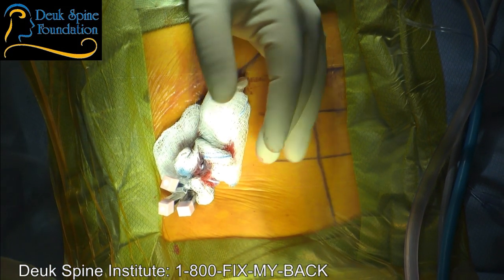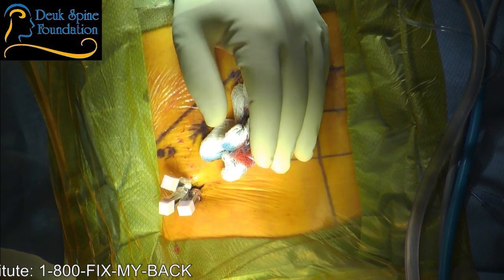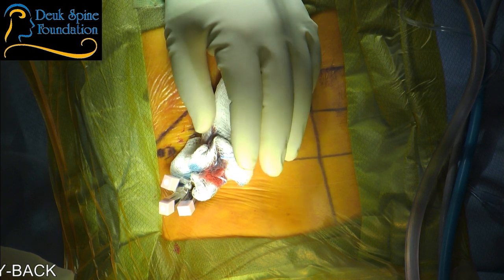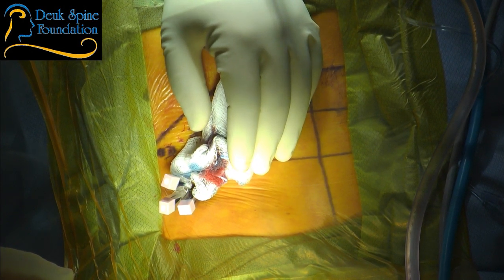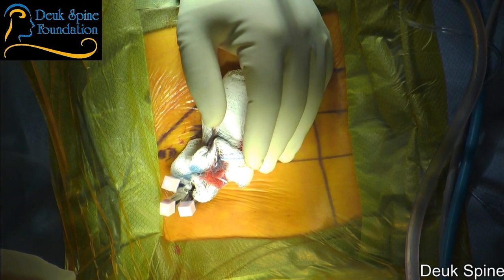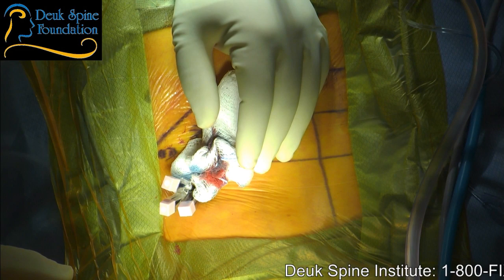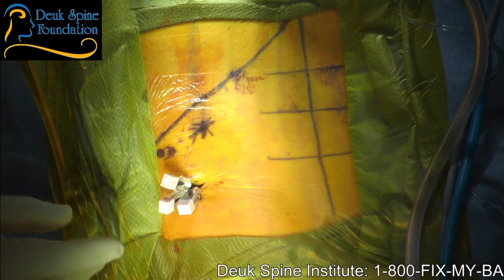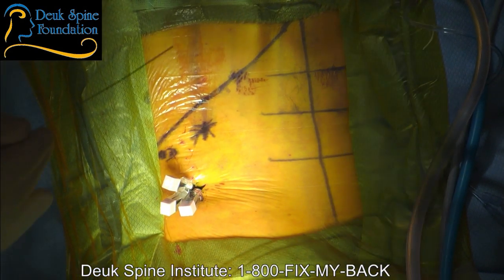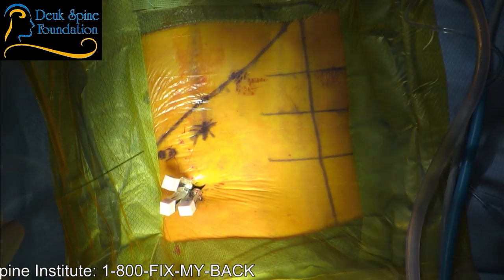But you're not really here for back pain. You're here for your leg symptoms. So we're really doing L5-S1 for the radiculopathy. Yes, we're doing it for the radiculopathy weakness rather than axial discogenic pain. But there are millions and millions of people living with back pain of the kind that you felt when I injected L3-4 and L4-5 and reproduced your pain. And that's the disc. It has nothing to do with the facet joint or the muscles. L5-S1 is 0, and then L4-5 was 8, I think, and then L3-4 was 9. And they're both concordant.